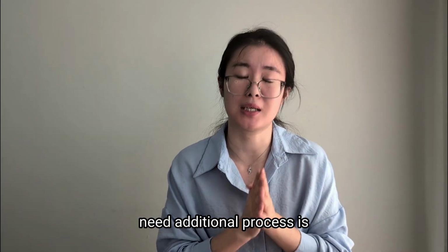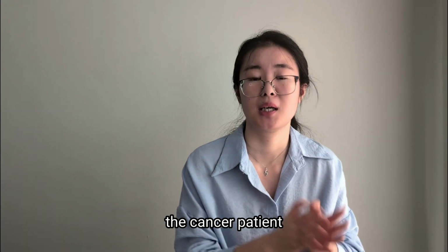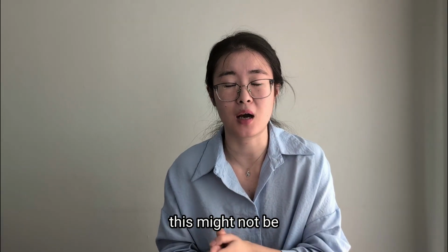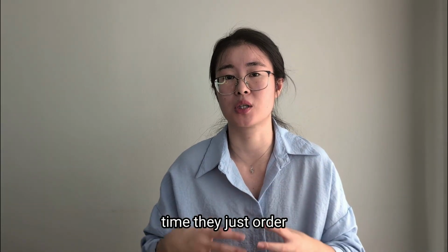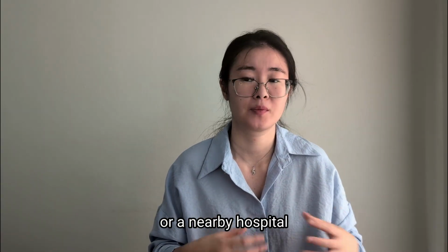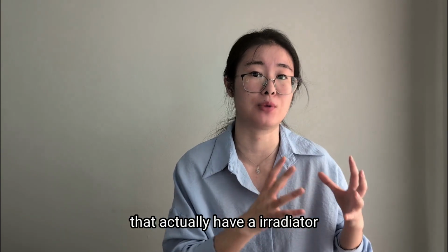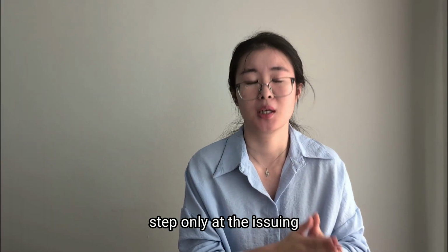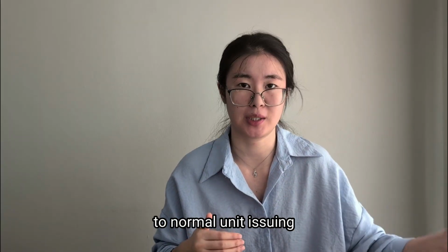The other large group that needs an additional process is the transplant patient or the cancer patient. They need the irradiated product. For some smaller hospitals, this might not end up with additional processing time, because a lot of the time they just order the already irradiated product from the Red Cross or a nearby hospital as their routine storage. But for some hospitals that actually have an irradiator, they will do this step only at the issuing, and that will cause extra time compared to normal unit issuing.